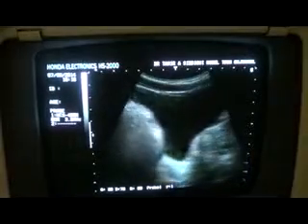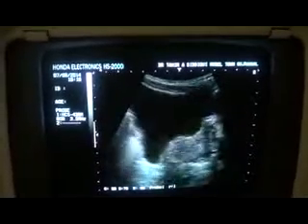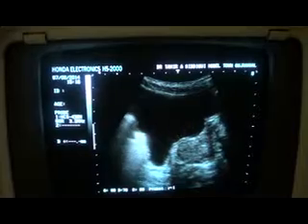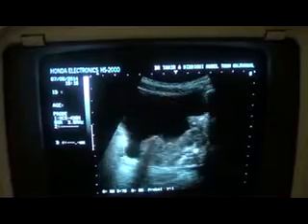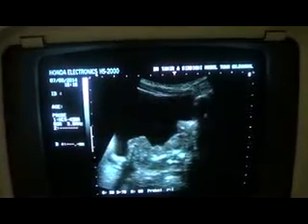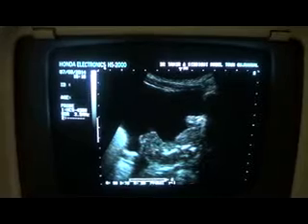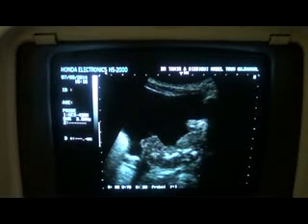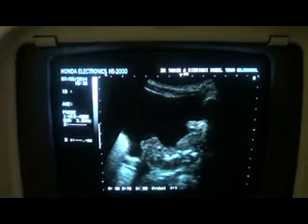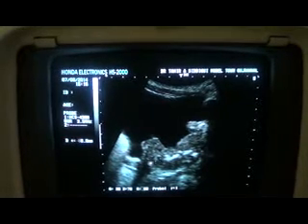Now, a little further study of the same patient. This is the longitudinal section, and you see that the urinary bladder walls are normal. All the wall is not thick, and in the prostatic fossa again we see echogenic heterogeneous mass with multiple calcifications in it. These tiny bright echogenic particles are representative of the calcifications.